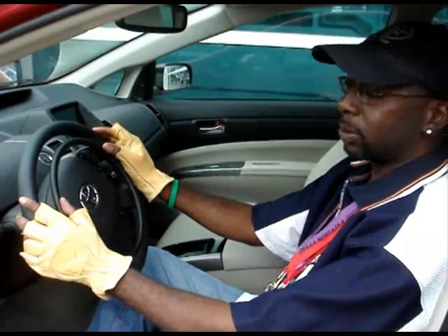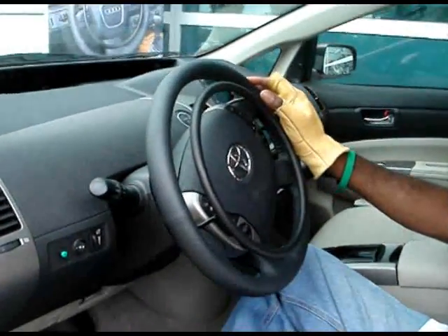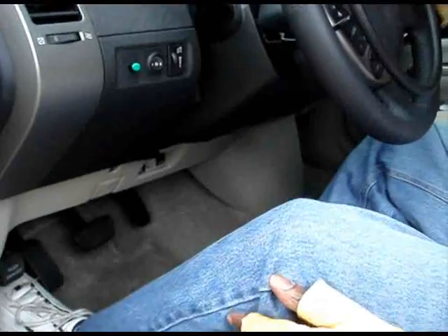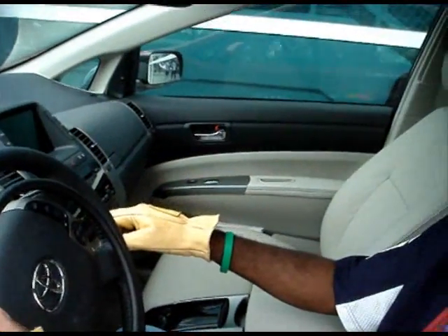Great hand control ability without having the cumbersome old hand controls. Nothing bothering your knees, clearance for your legs. I can reach the brake very easily, and feel comfortable driving.